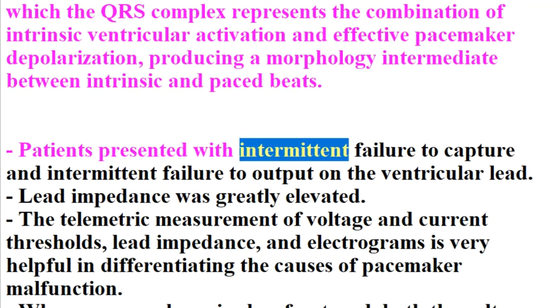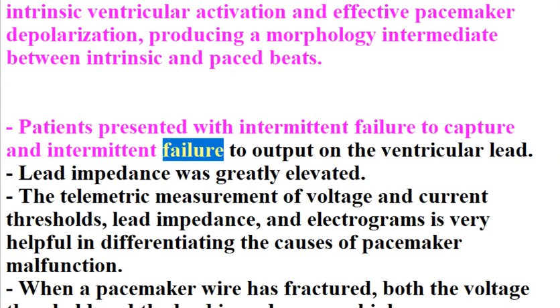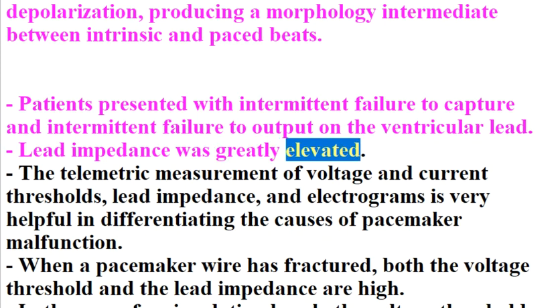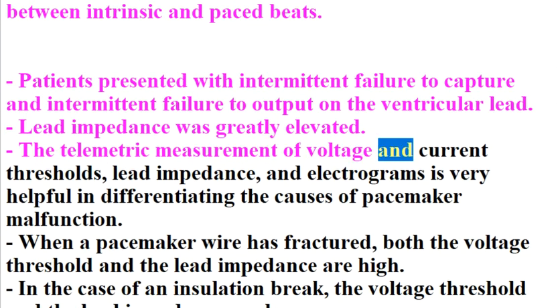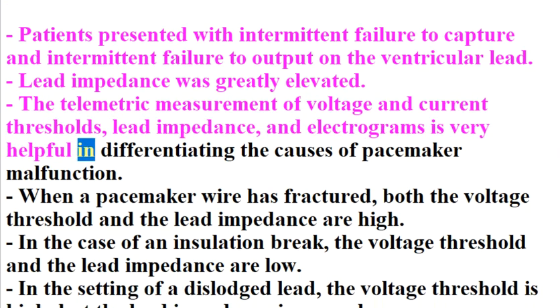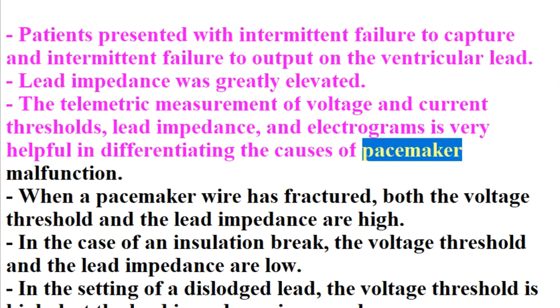Patients presented with intermittent failure to capture and intermittent failure to output on the ventricular lead. Lead impedance was greatly elevated. The telemetric measurement of voltage and current thresholds, lead impedance, and electrograms is very helpful in differentiating the causes of pacemaker malfunction.